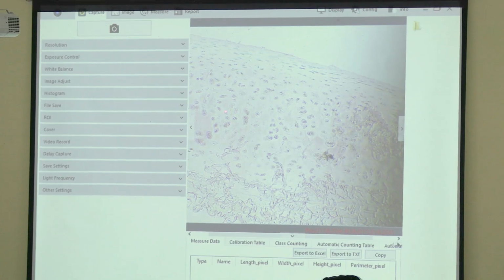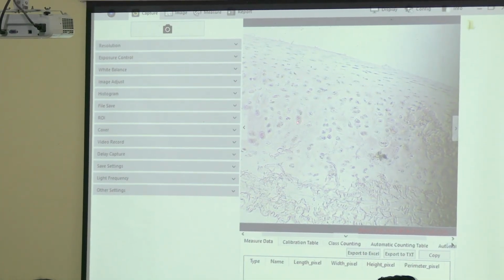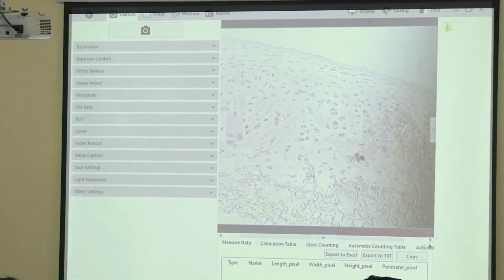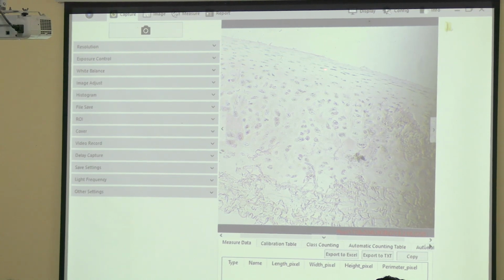Here you see groups of cells. Here there is 1, 2, 3, 4. These are called cell nests, right? And if you go outside, this thin layer is called perichondrium. This perichondrium is absent in fibrocartilage, but it is present in hyaline and elastic cartilage.